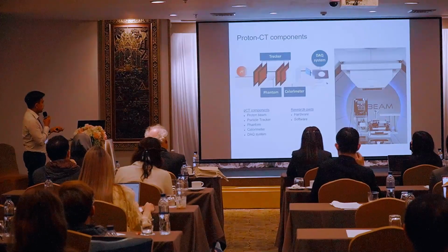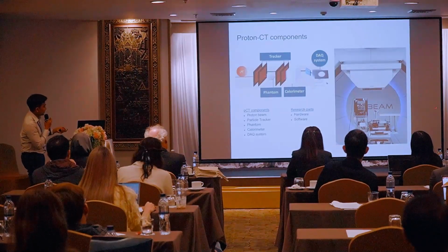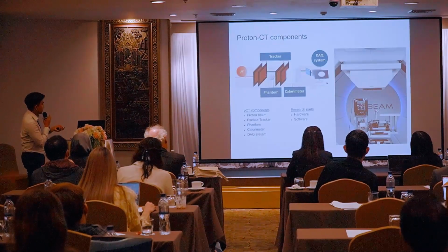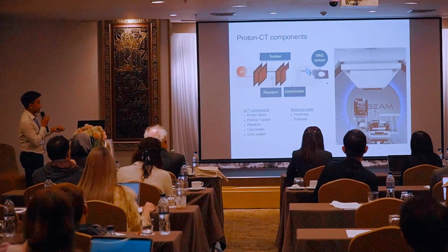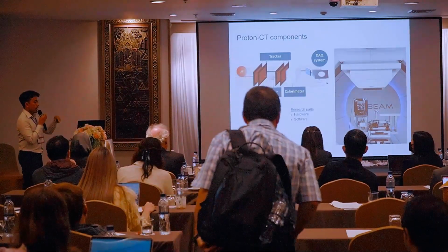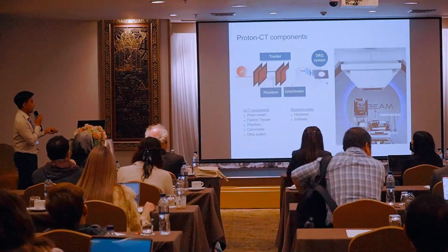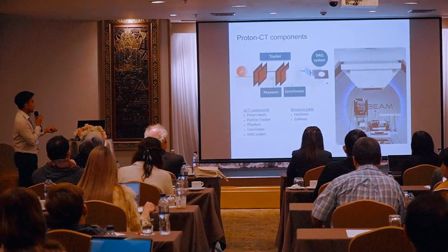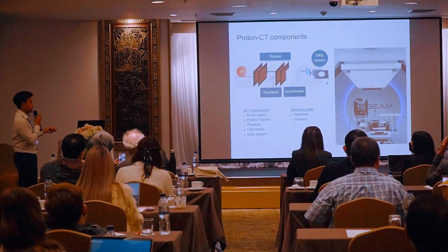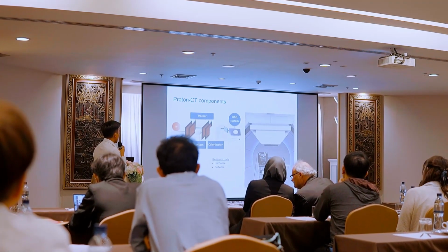You can see that we have a proton beam. Actually, I didn't move the gantry here. I mean, the gantry should be here, and the proton comes from the right to the left, and then here is the acrylic that we are going to use as the phantom. It is a quarter of a cylinder of acrylic, and then these are our range sampling calorimeter that I will talk about later.